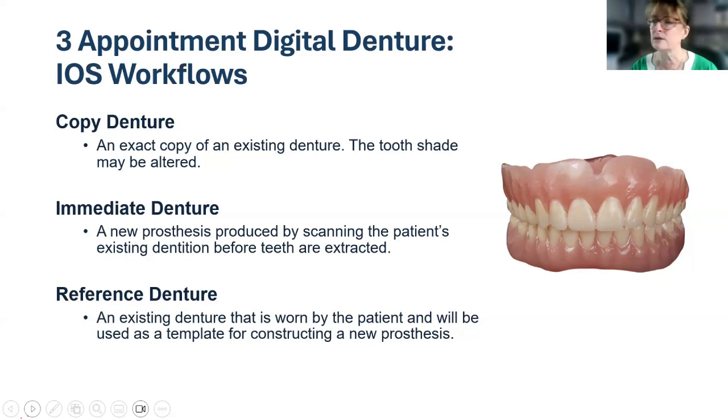And then lastly is the reference denture, and the reference denture is my personal favorite, and I've got some slides here on it. But think of taking that existing denture and using it to be the best custom tray you'll ever have. So oftentimes I find doctors are like, oh yeah, no, I don't want to use that old denture. It's terrible. It doesn't fit.